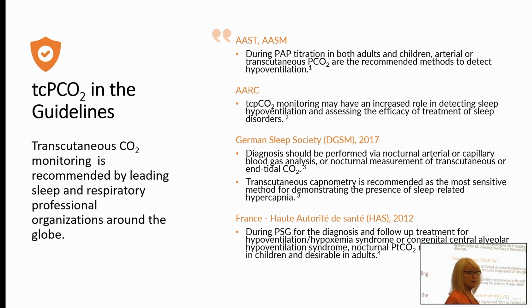Transcutaneous monitoring has been recommended by respiratory organizations. The AAST states that arterial or transcutaneous CO2 are the recommended methods for detecting hypoventilation during PAP titrations. The AARC notes that transcutaneous monitoring can have an increased role in detecting sleep hypoventilation and in assessing the efficacy of the treatments that we're using for sleep disorders.